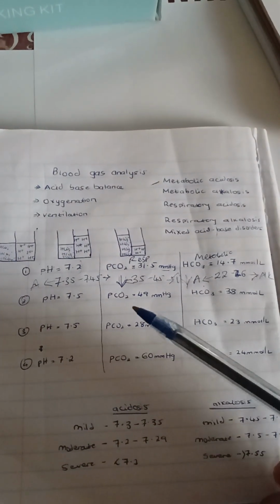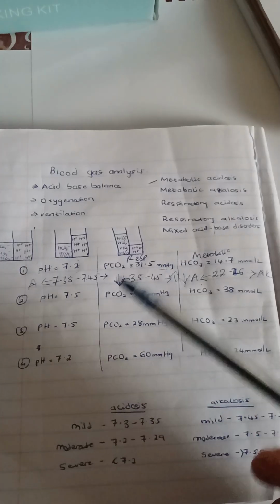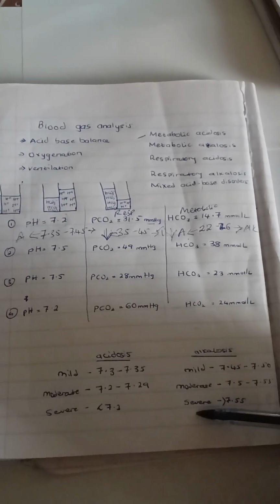Now finally, one more thing is we can classify acidosis or alkalosis in terms of severity, whether it's mild, moderate, or severe. If the pH is between 7.3 to 7.35, it's mild acidosis. If it's between 7.2 and 7.29, it's moderate acidosis. And if it's less than 7.2, it's severe acidosis. In terms of alkalosis, if it's between 7.45 and 7.5, it's mild alkalosis. Between 7.5 and 7.55, it's moderate alkalosis, and more than 7.55 is severe alkalosis.